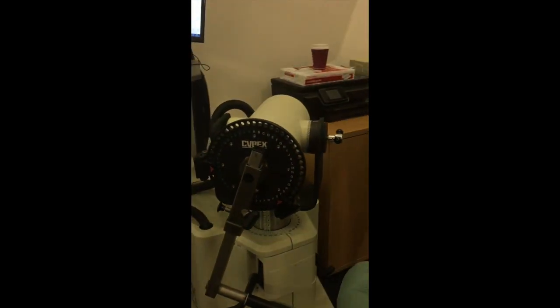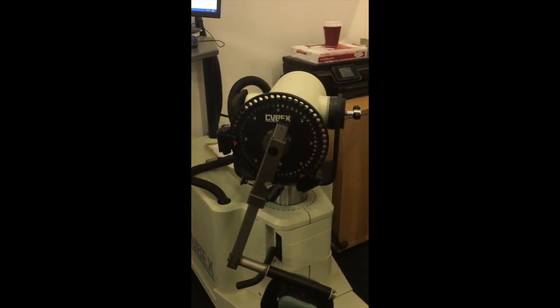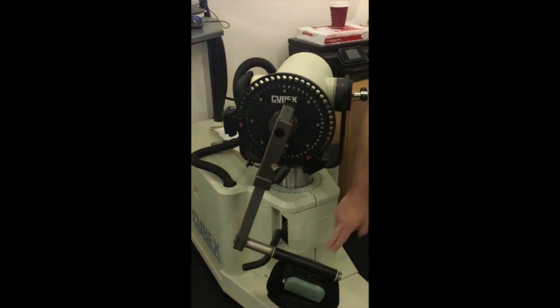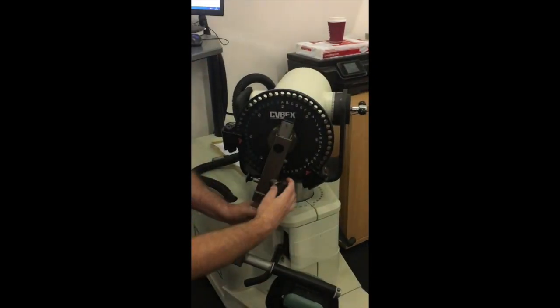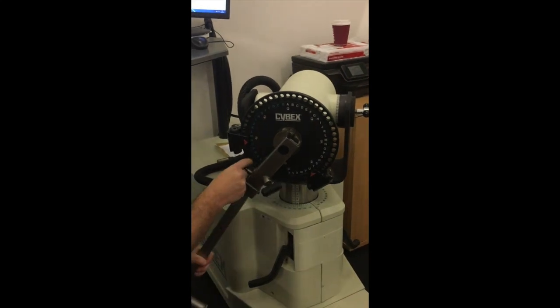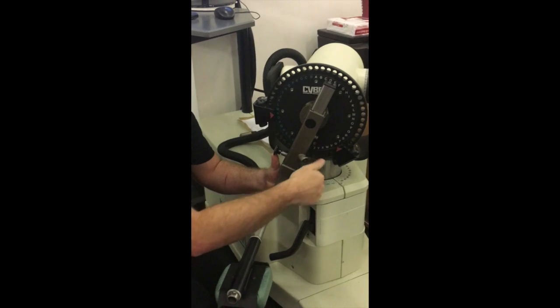Can you now see I've put the adapter on wrong? You're not going to be able to. Can you see how this is now going to test a knee? The adapter, this bit. Can you see how I've done that wrong now? Alright, so that, in reality, has to come out and go that way.